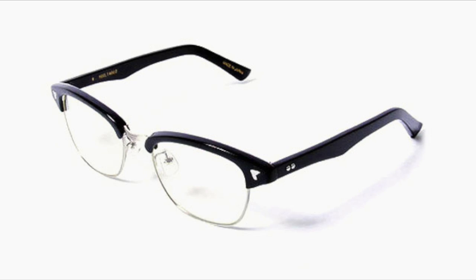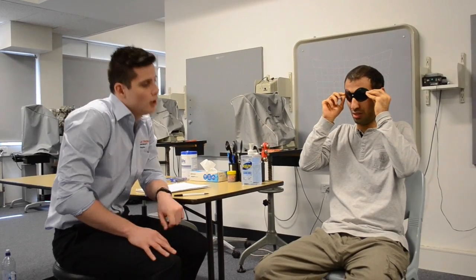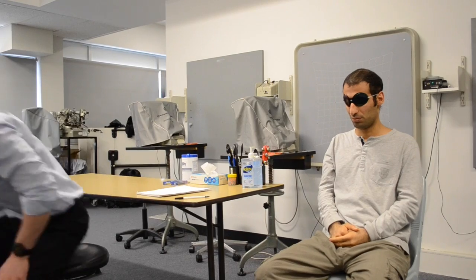The patient's own distance refractive correction should also be worn. After confirming the goggles are comfortable and the lights are turned off, the patient is asked to look down at the chart at the bottom end of the room.